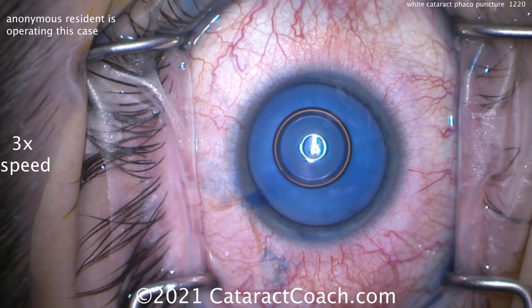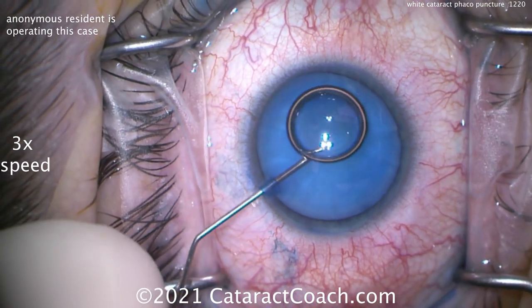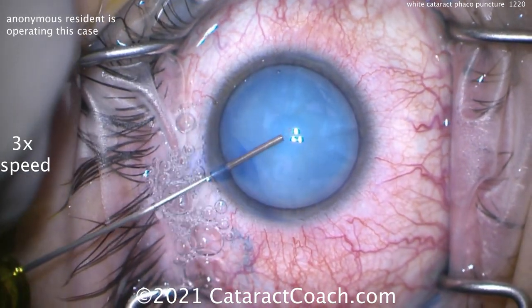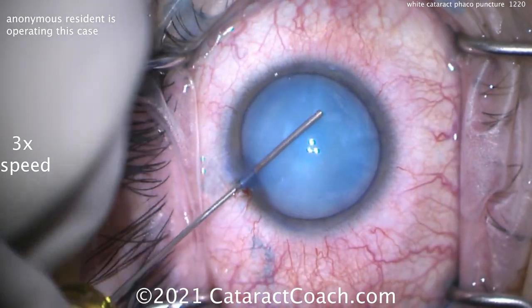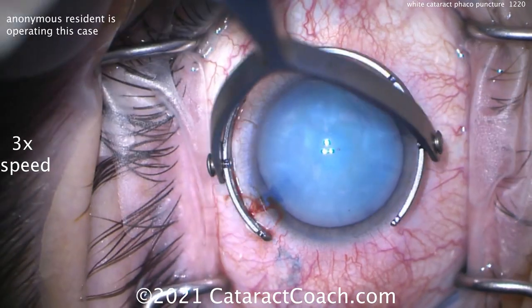Now washing out the blue dye, putting a little anesthetic inside the eye. And here comes the viscoelastic — a dispersive viscoelastic, filling it up, getting a nice high pressure. Touching the lens capsule, you can see it's really bouncy. That lens is pressurized. It's not a dense cataract.